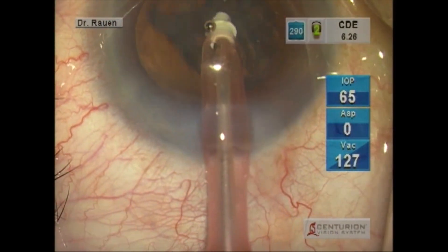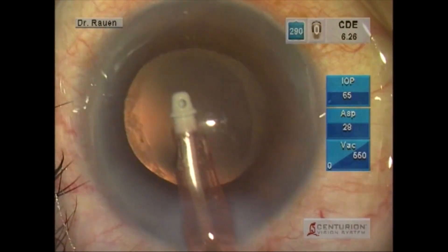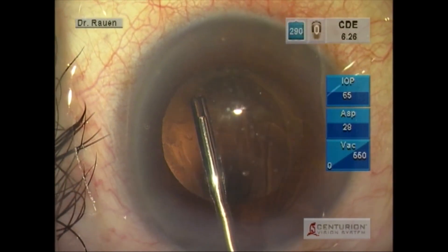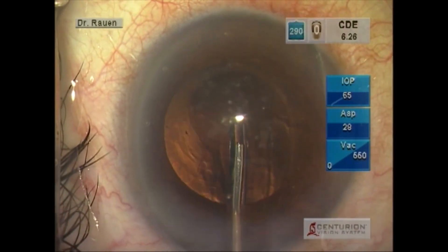We like to use the polymeric tip as I think it adds safety and allows us to polish the capsule. In this case we also use the Teri squeegee for final polishing, right before injecting our viscoelastic.